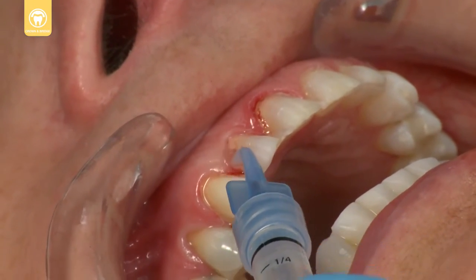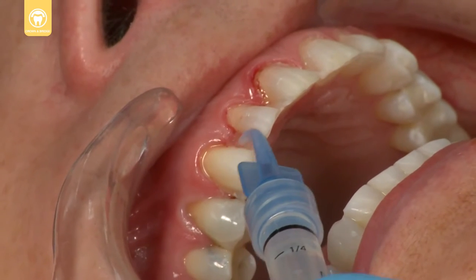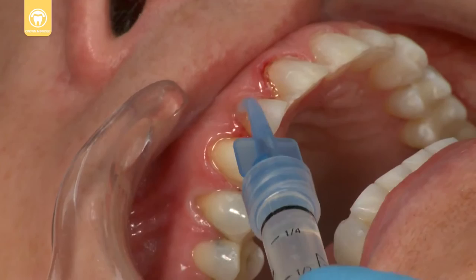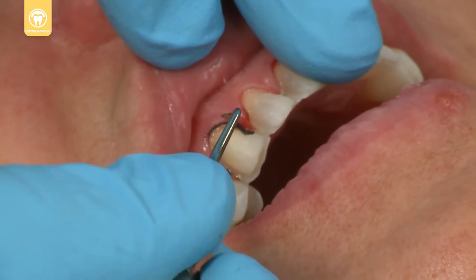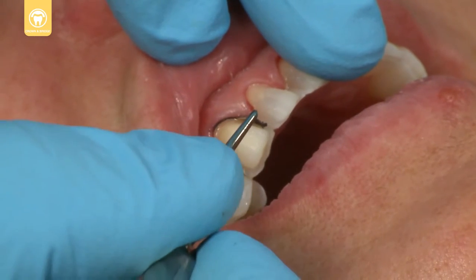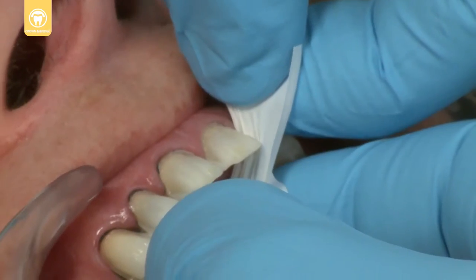If needed, use ViscoStat Clear to control bleeding and sulcular fluids. Retract the gingival tissue with UltraPack knitted cord and isolate the adjacent teeth with Teflon tape.